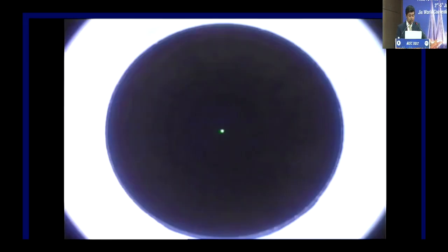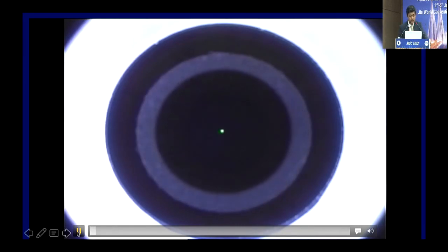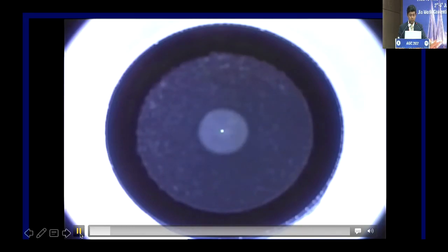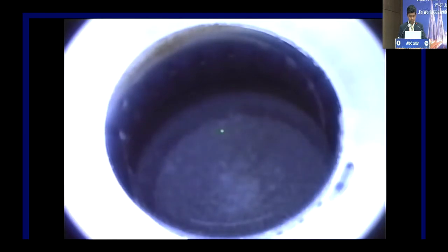So first, this was a case of SMILE where I had a suction loss. Everything was going well. This patient seemed fairly cooperative. But suddenly at this point of time, the patient moved and the suction was lost. Actually I thought the suction was gone, but in fact it was not. Because there was a sudden jerky movement, the suction was immediately applied again, but it was a pseudo suction. The limbus and conjunctiva had gone into it.